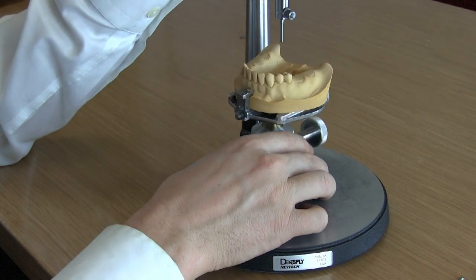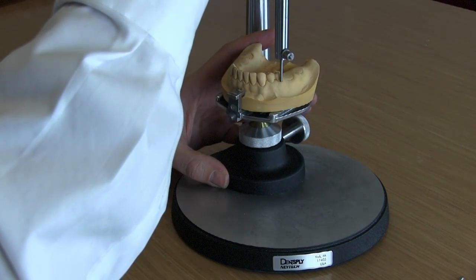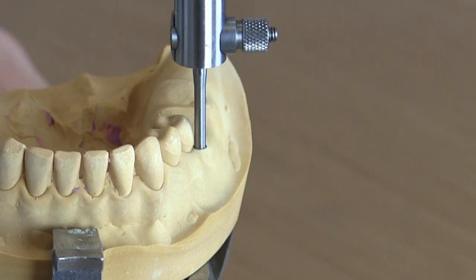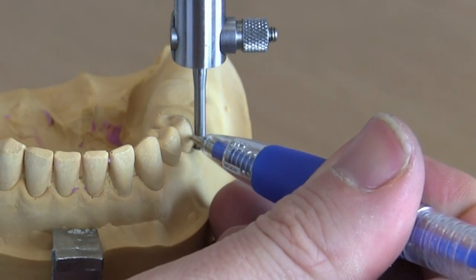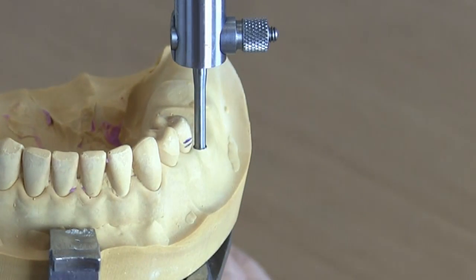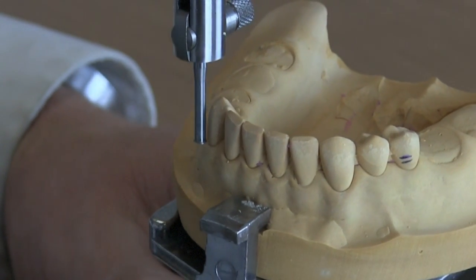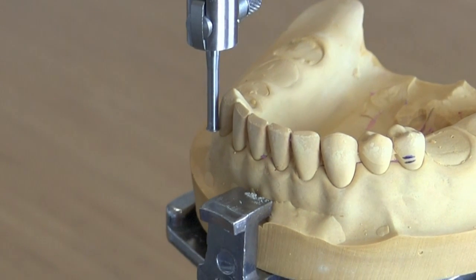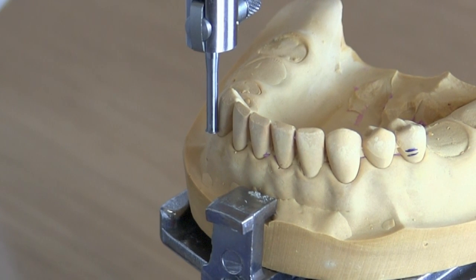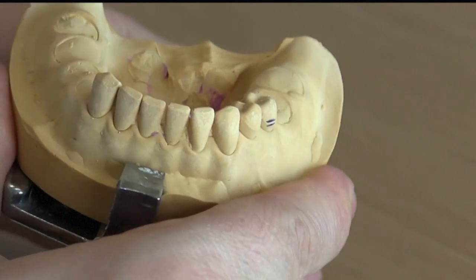Having measured those guide planes, I can see from experience that they're going to be insufficient for giving us good retention. Let's get a close up on this — we're super low, almost on the gingival. We need to stay about four millimeters above the tissue, and we're well below that. We're almost sitting on the tissue, which will create inflammation and a problem. We've got the lowest undercut gauge and we're almost sitting on the tissue, yet we're still not even touching the vertical bar. That's a problem, and it's very common on the bottom jaw — usually this situation from canine to canine with the anterior teeth.